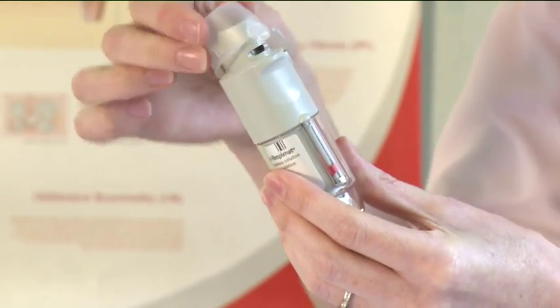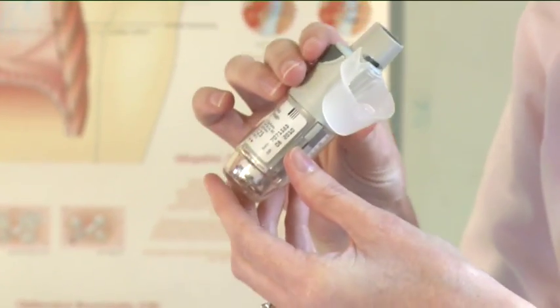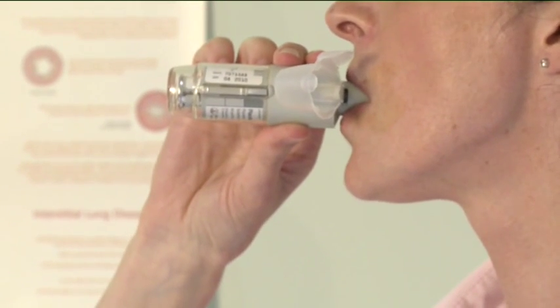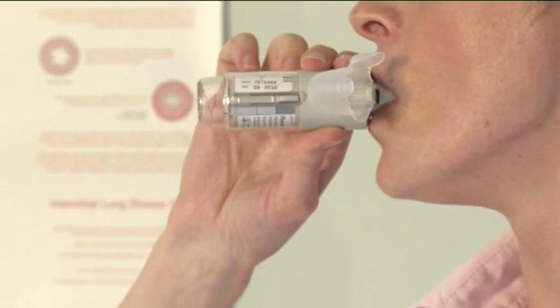Breathe out slowly and fully, and then close your lips around the end of the mouthpiece without covering the air vents. Point the Respimat inhaler to the back of your throat.